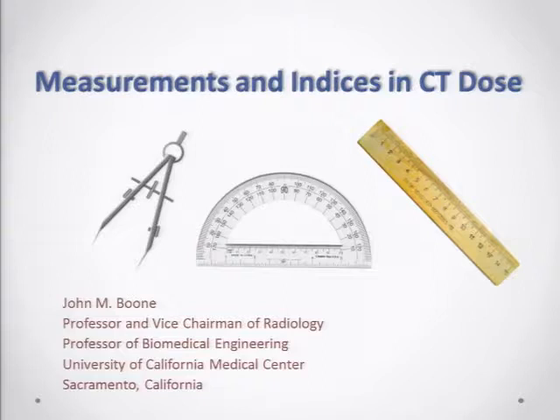I have two questions. One, have you compared the solid state with your thimble chamber? And number two, I did some measurements using three 32 cm phantoms slapped together, and did measurements both with the CT dose probe from RTI and some TLD. So I was wondering if you compared those phantoms.